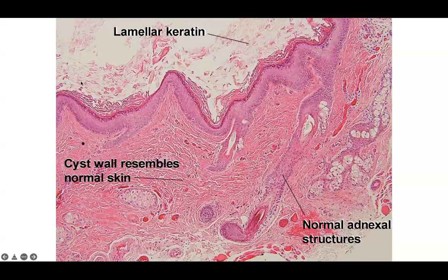You can see that it looks like an epidermal inclusion cyst with this shredded wheat, onion skin, lamellated keratin, and retained granular layer with stratified squamous epithelium, but you can appreciate the direct connection of multiple pilosebaceous units. So it actually has adnexal structures connecting to it. And that's why you'll often see a lot of hair within the cyst as well, because the hair shafts from the adnexal units are going into the lumen.